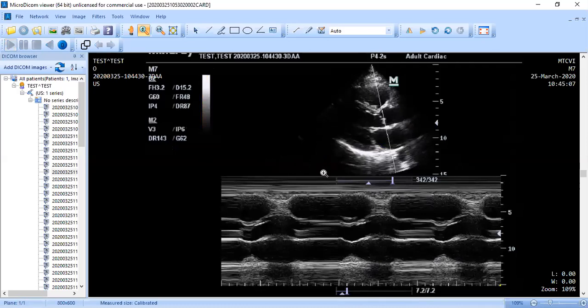Now we're going to go do our M-mode sweep. So we're going to cut right across the aortic valve there. Okay, and we want to try to get our nice box that we see right here. That's the aortic valve open, closed, open again, closed, open again right there. We got 3 beats that we're seeing it open. That's what we want to see.